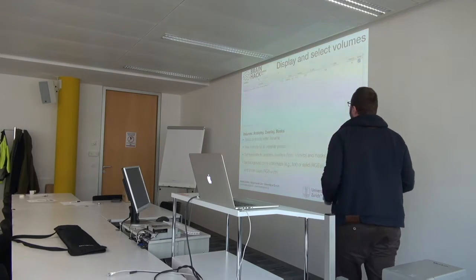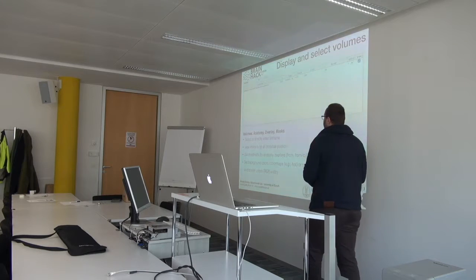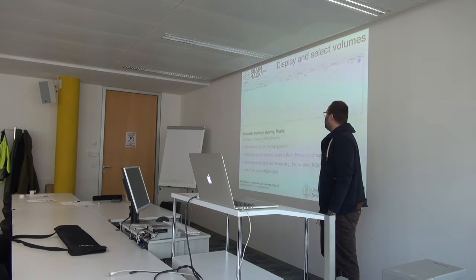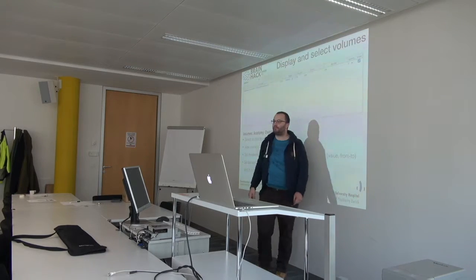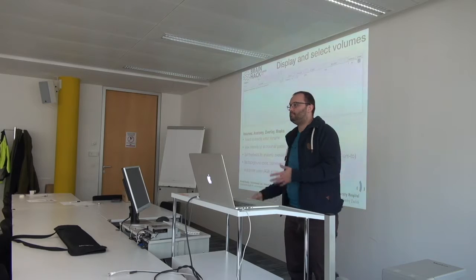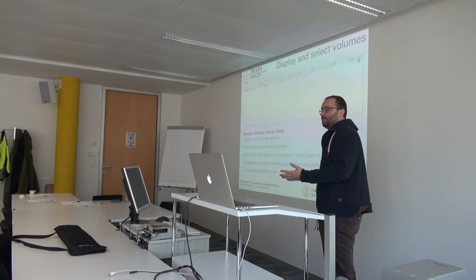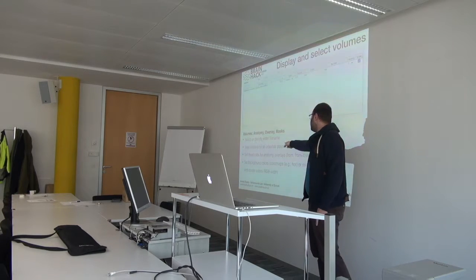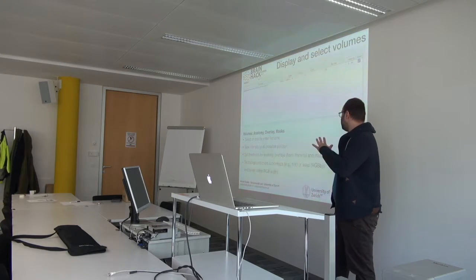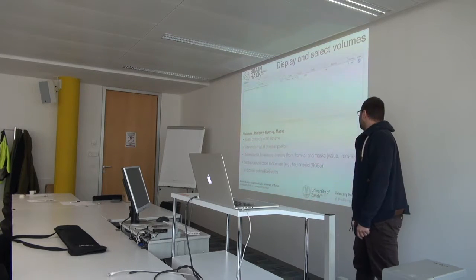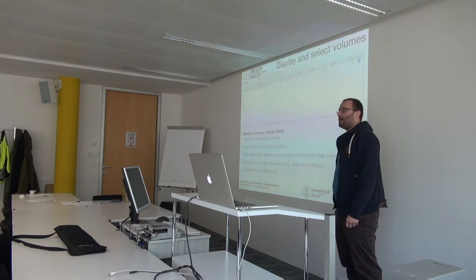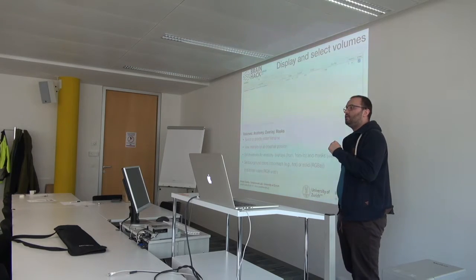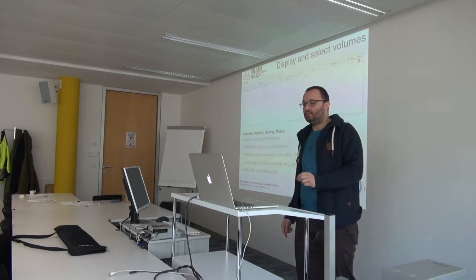For image management, you can add anatomy images, overlays, and masks using the add button, or directly paste in the file path and press enter — no need to click through several dialog windows. You can select different thresholds for anatomy, overlays (from and to, for windowing), and masks (from and to). Importantly, some masks have discrete values — one region encoded as one, another as two — so you can also select a single integer to display just one part of the mask.